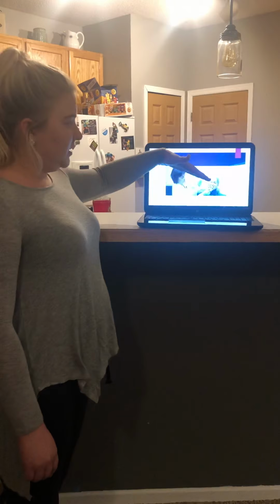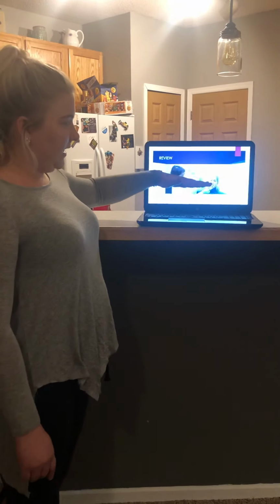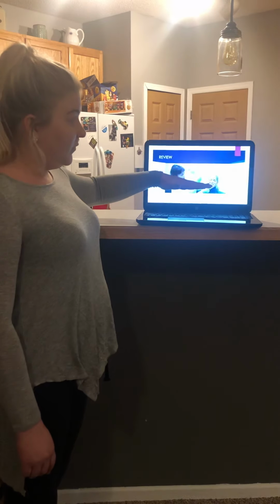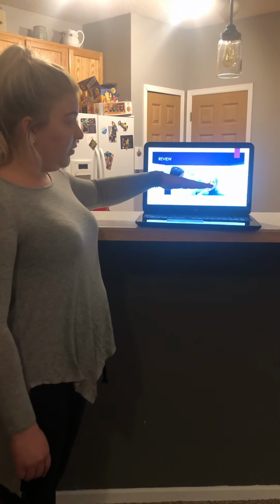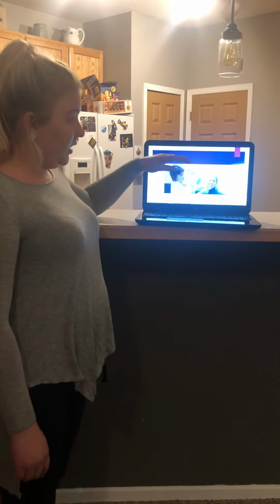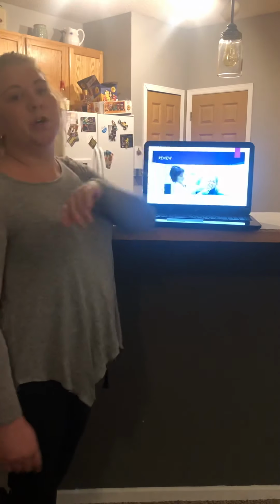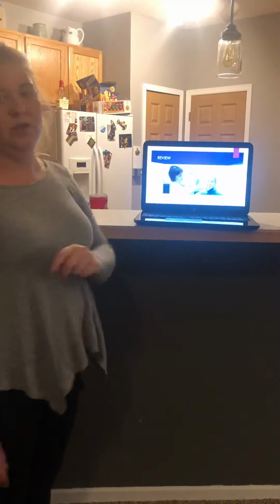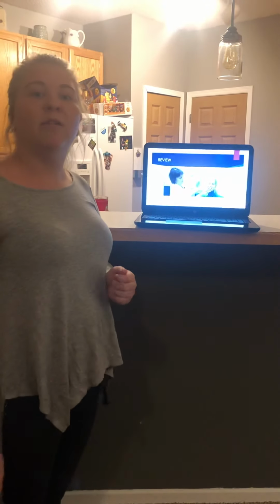So if she was using not enough vertical angle, it would be down like this. We would get elongation of the tooth. And then if we were too high, we would get foreshortening of the tooth. But she's using positive vertical angle in order to get the diagnostic photo of a periapical.